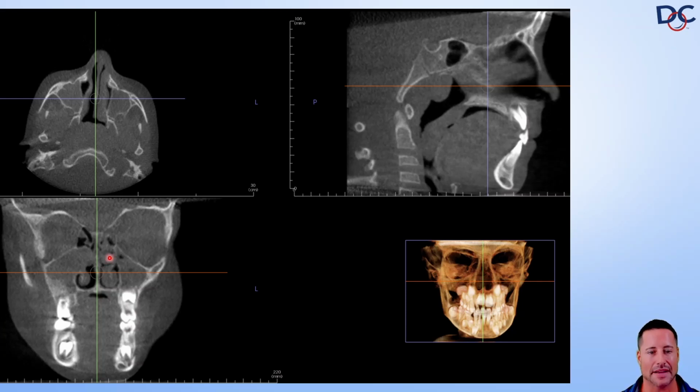I mean, look at the chronic inflammation this kid is experiencing. And when you ask the parents, does he have a cold? No. Is he a little stuffy? He's always stuffy. Okay, so then you start showing them this, and they're in awe. They're in awe of what you were able to determine. You don't treat this. I don't say orthodontics or expansion ever fixes this. We'll talk more about that in some upcoming podcasts.